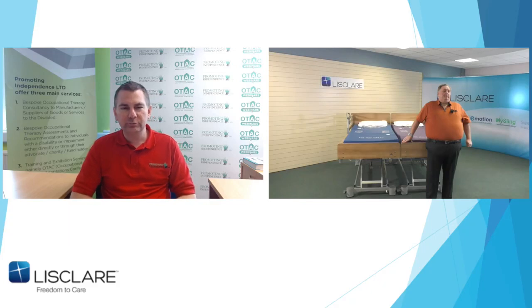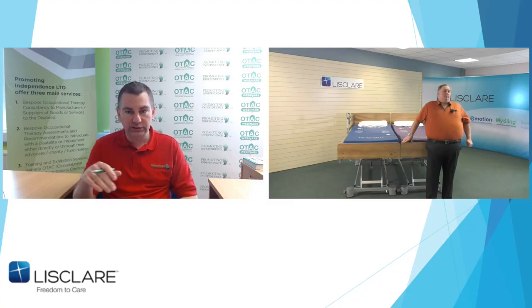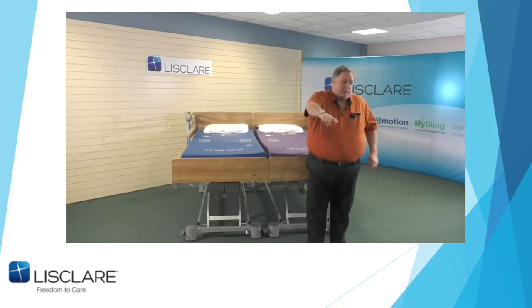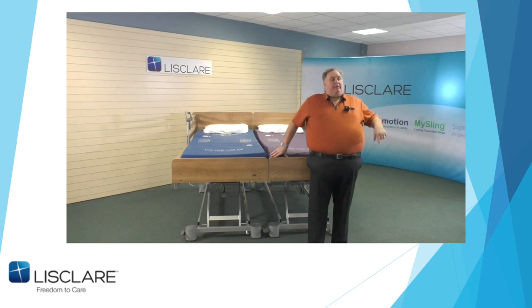Superb. So if they didn't have built-in wardrobes, would you still say you need a minimum of 90 centimetres off the back wall, or would you presume that you would walk around the side and the front, not the back? No, as you can see, that's just leaving walking space, because the bed's actually 196 centimetres, but I've allowed 0.5 metre so that somebody can get around the bed, to be able to get access, because you need to be able to get around.